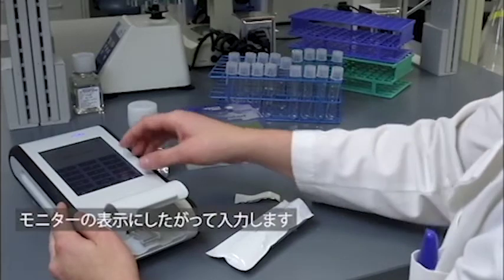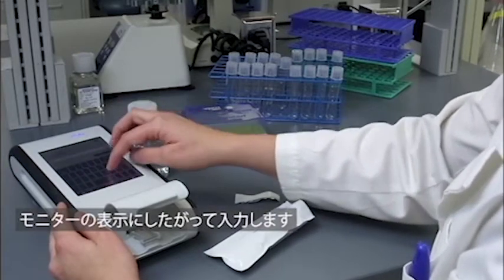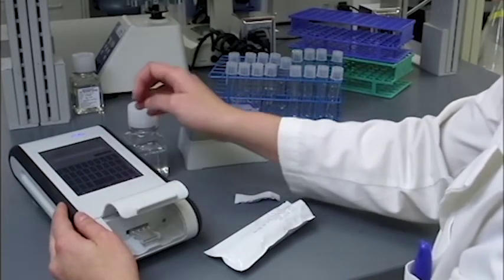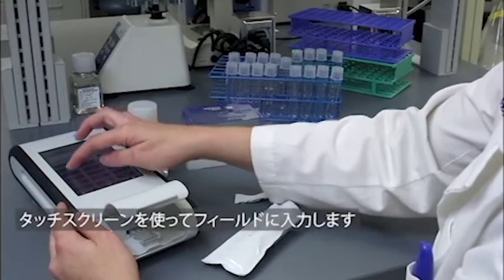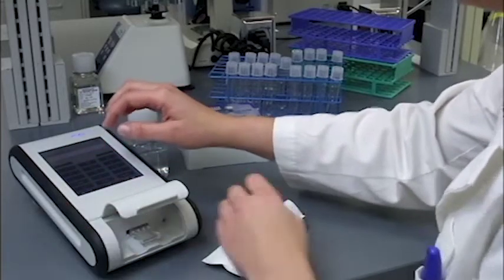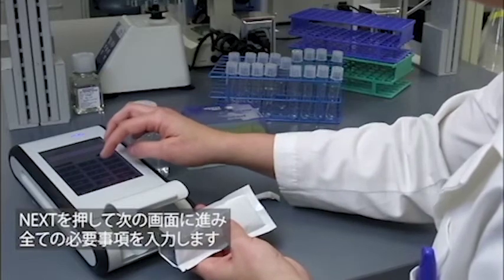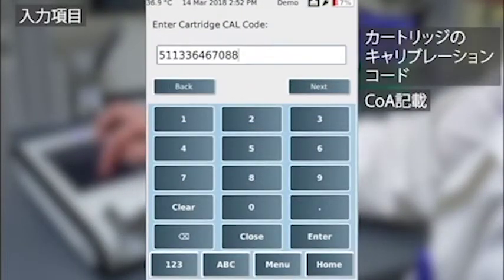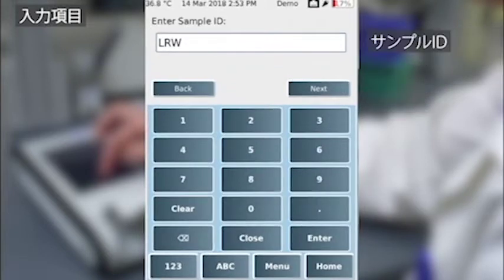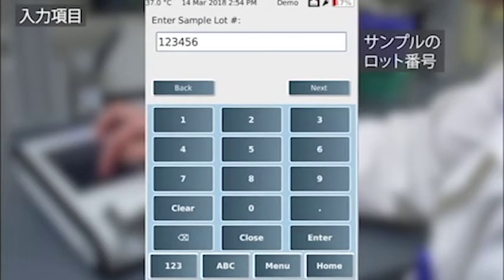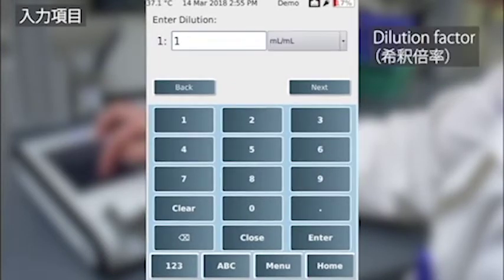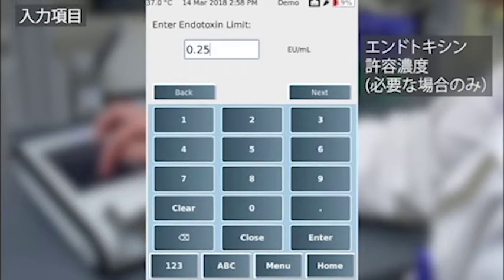A series of prompts will appear for you to enter the information necessary to run the assay. Using the touch screen, enter values for each field, clicking Next until all fields are complete. Include cartridge lot number, cartridge calibration code, sample ID, sample lot number, dilution factor, and endotoxin limit if applicable.